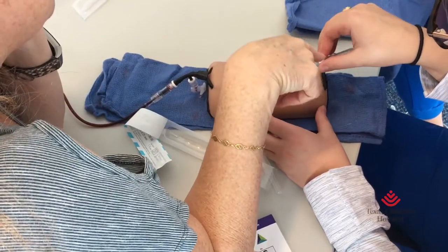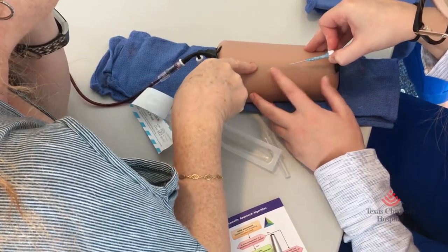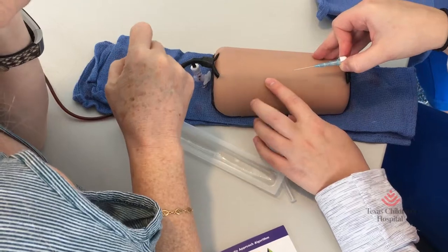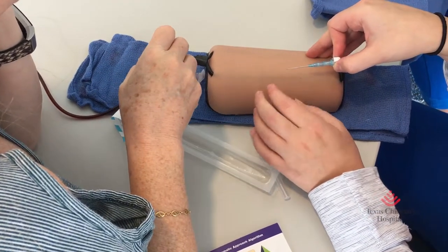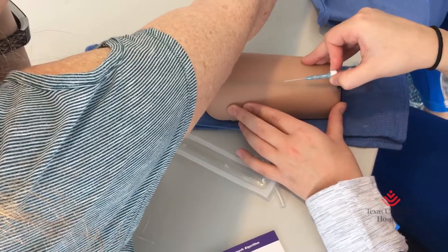See how she does it. There you go — now rest it. You want to feel for your vein first of all, then clean. You don't want to touch it after you clean — you're introducing all kinds of good stuff. This one's going to be smaller, so go for the big one first until you feel better about it.